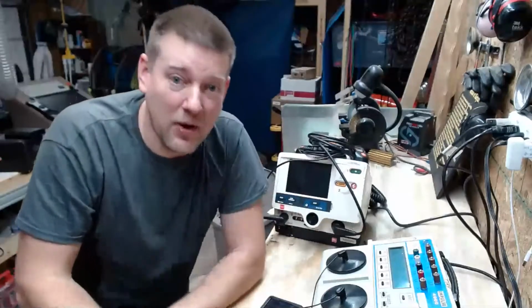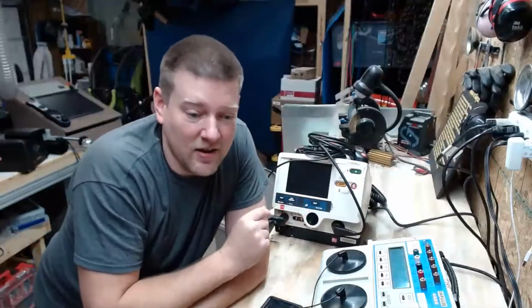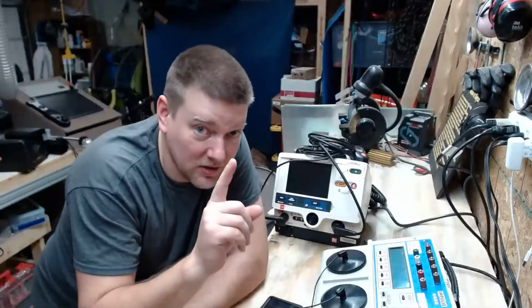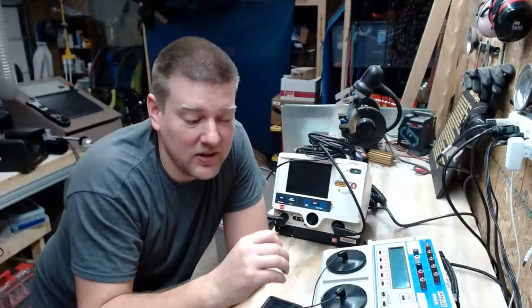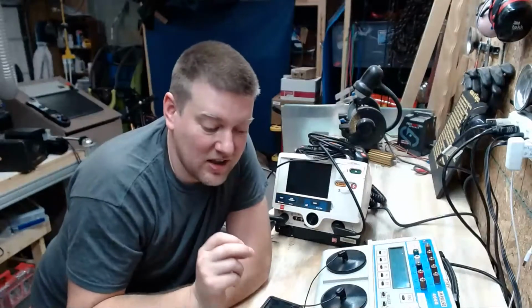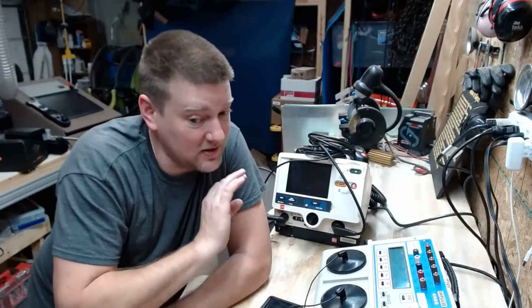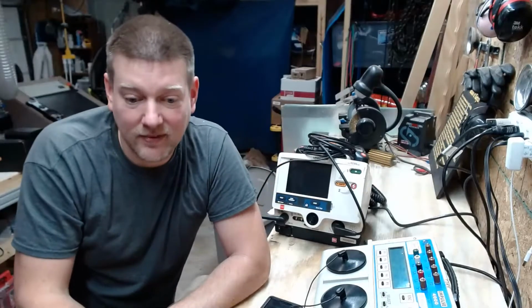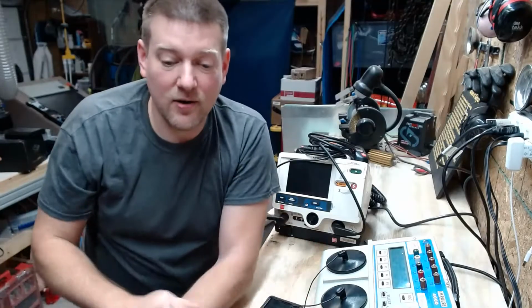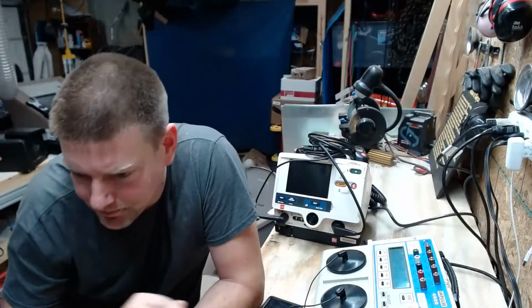So guys, CYA, cover your ass, document everything appropriately, and take a firm stance that after something leaves your hands, you have no control over its serviceability. That's up to the users. The users are putting that device or that cable on a patient, not you. If there's damage at the moment it's used on a patient and the users didn't take notice of it, it's on them. It's not on you, because you have no control over that device, those cables, whatever. The second you hand it over to somebody else, you have no control over it. So be sure to take that stance, guys.